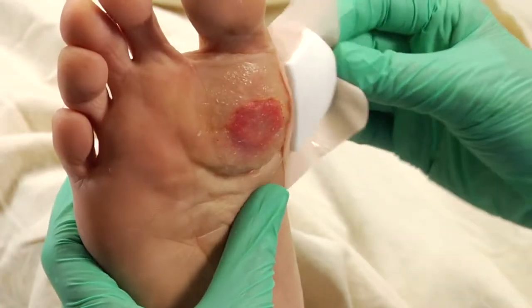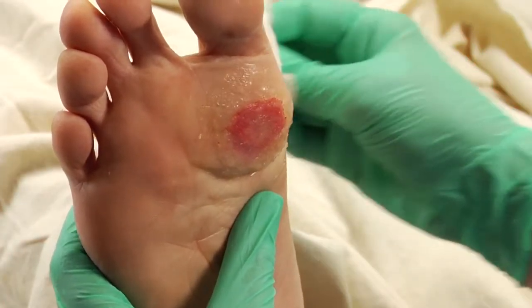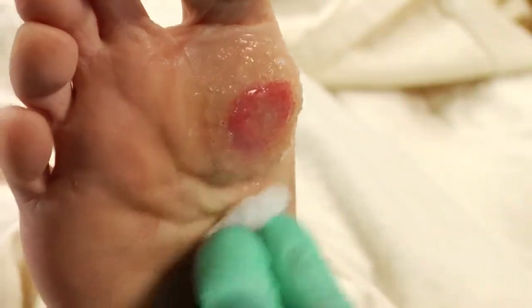Silvasorb Gel is normally removed with the cover dressing. Any remaining gel will be removed with wound cleansing.